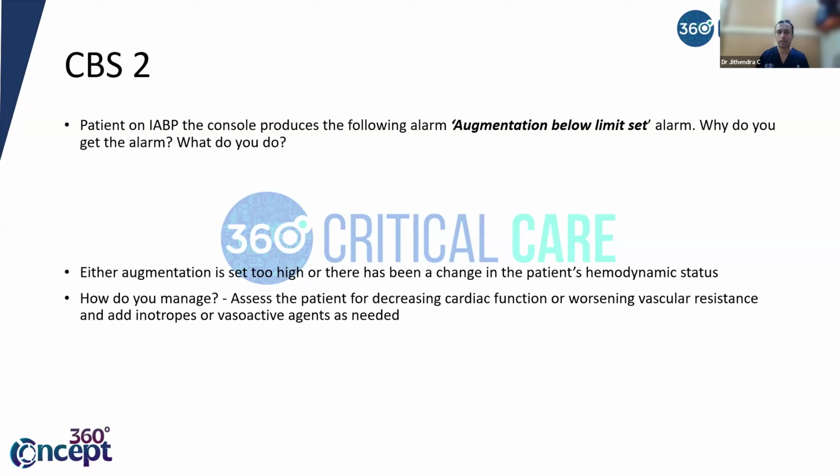You can understand this. Augmentation below the limit. So you say there was significant augmentation happening. Now you see that the augmentation is not happening. Either the underlying heart itself, the only reason, if the machine is not having a problem, the only reason is the heart function has gone down.